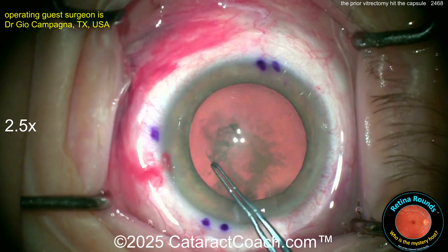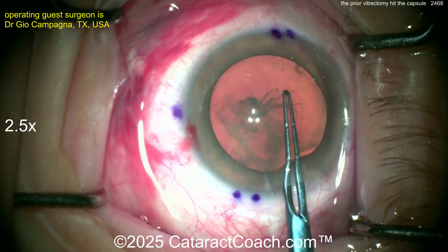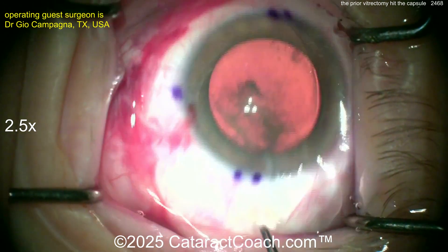It's time for the cataract surgery. Important to get a good rhexis. You may be putting in a toric lens — sure, if you want to — but what if the capsule rips open? Then you may be putting in a three-piece lens with optic capture. So, important to get that five-millimeter rhexis done. That looks fantastic. Looking good.